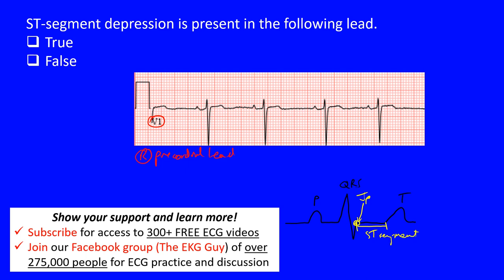Our question is looking at the ST segment and whether there is depression or not. If there's depression, we have to find that PR segment — that's what we use as our baseline. We measure this and draw a line. If the ST segment was above that line, we call it ST elevation. If it was below, we call it ST depression. We use that J point specifically to measure any ST segment elevation or depression.